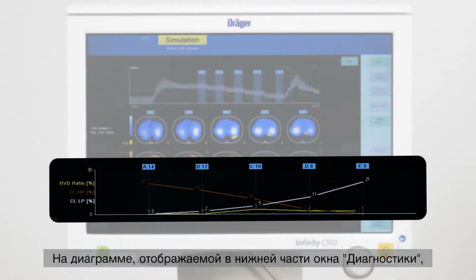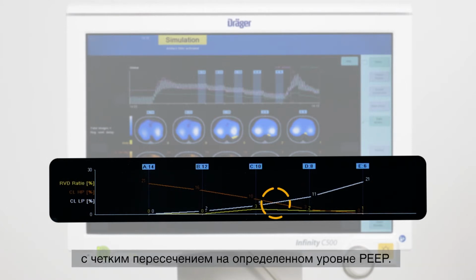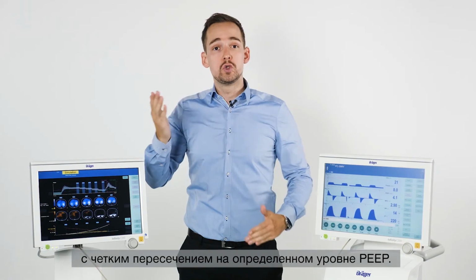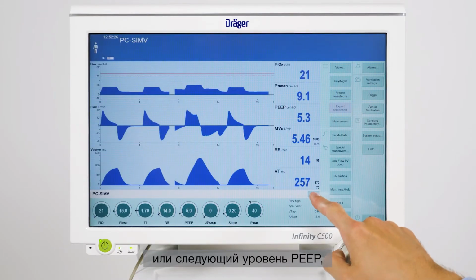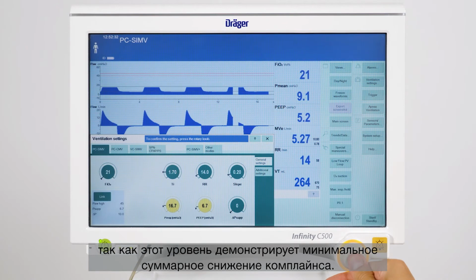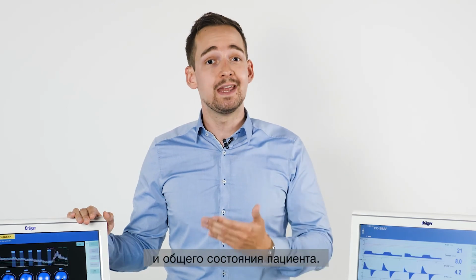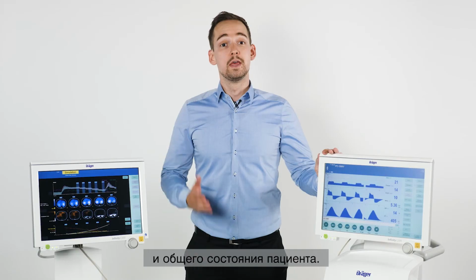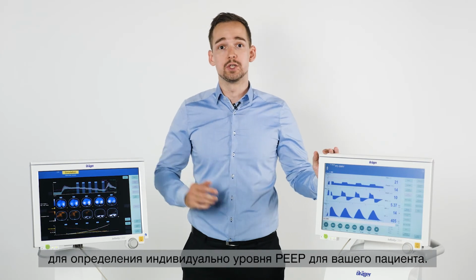In the diagram, which is displayed at the bottom of this diagnostic view, we can observe an opposing trend of collapse and overdistension with a clear intersection at a certain PEEP level. To personalize PEEP selection, we could choose this or the next higher PEEP level, as this level shows the minimal amount of total compliance loss. The final decision, of course, depends on multiple parameters and the overall patient condition. So this is one possible workflow on how to find the individual PEEP for your patient.